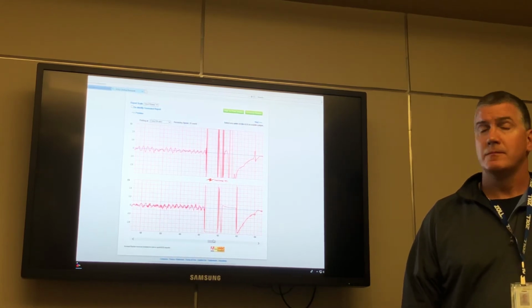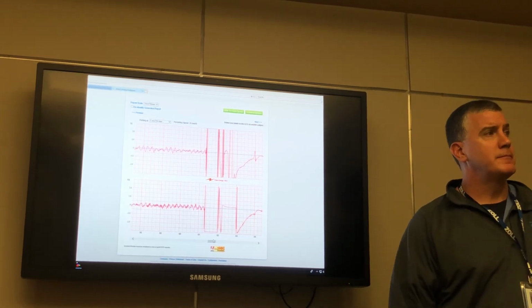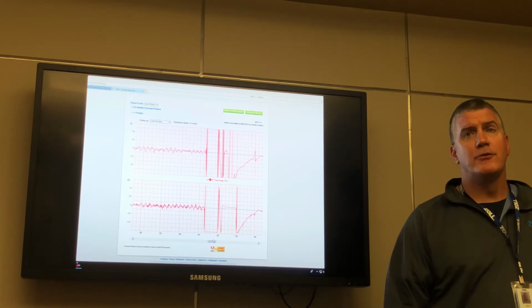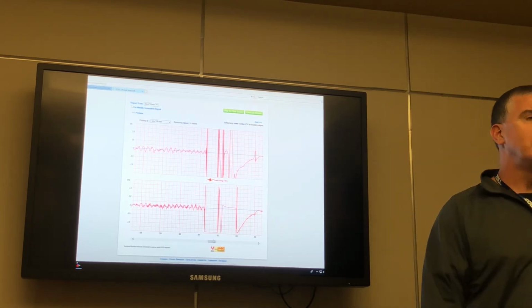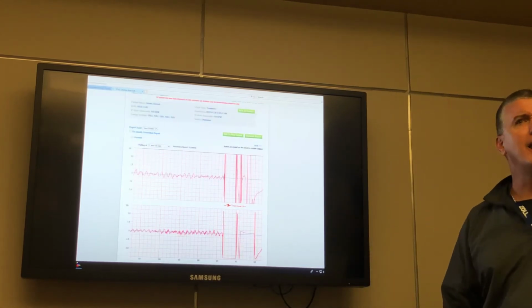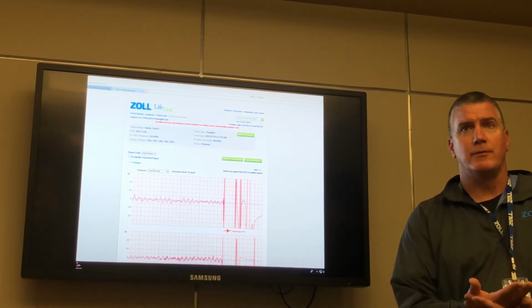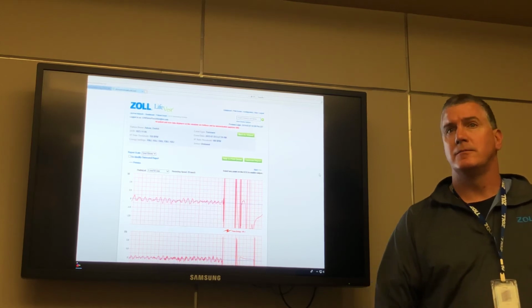So it's not like you can email it. John, if it's emailed, we could snip it and then snip it into another. Yeah, but there's lots of pages. Some of them can be 10 pages, depends on the info. But that one picture where all those graphs were would be a really good snippet. Yeah, you're talking about the summary page? I like to print out that summary page and have it in the chart. I've seen doctors have it in their chart, and when they go in to see a patient they have that information right there.